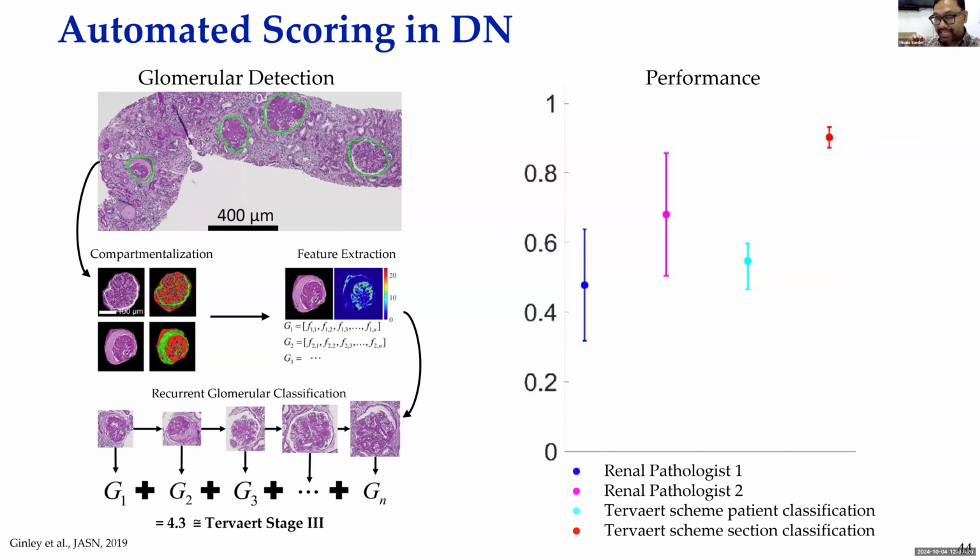Then going back to another example, another case study is comparing amyloidosis versus diabetic nephropathy. We know these two are mimics, both affected by nodular changes. The question is, if we talk about nodular changes, how can we find something, based on our features, that shows they are still distinct? Because it may not be apparent to someone who is not coming from pathology.